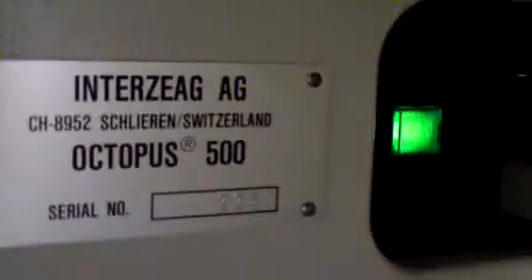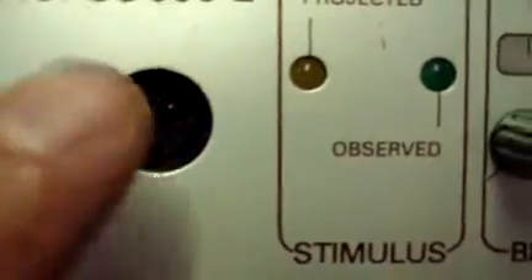Looking at the Octopus 500 Visual Field Analyzer. It is getting power, as you can see, but for whatever reason the screen is not coming on. I don't have the piece that plugs into here.